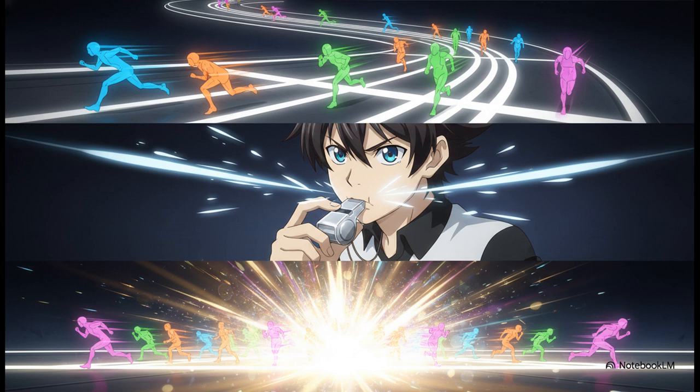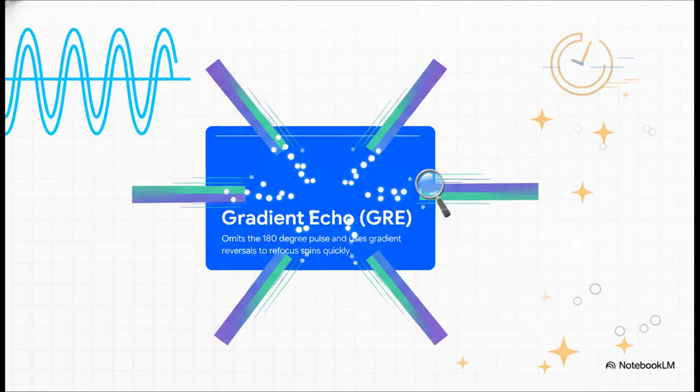Because the fast runners now have further to go, and the slow runners have a much shorter distance, they all cross that start line at the exact same millisecond. That perfectly synchronized moment, that's the powerful signal the scanner reads. On the other hand, we have the gradient echo sequence, or GRE.